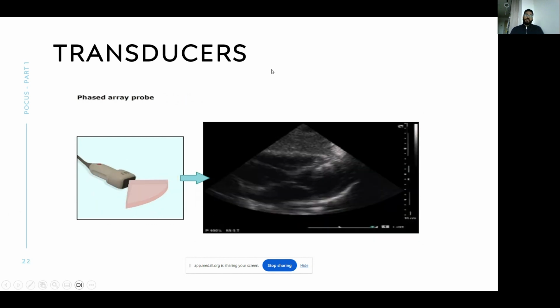And now coming to the phased array probe. The phased array probe was the genius of clinicians and physicians wanting to see a live heart beating. In the late 70s, when X-rays were available, people could see the outline of the heart, but it was very difficult to see the inside of a living person's heart. So when ultrasound and sonar started coming out and people decided to use ultrasound in medicine, they were thinking, how can we use this to see inside the heart of a living person?